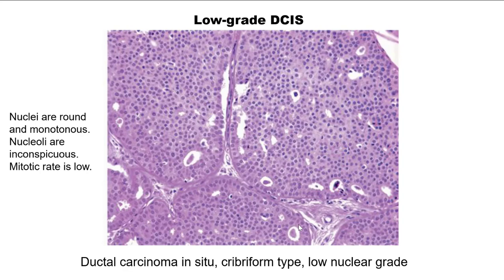Here is an example of low-grade DCIS showing relative uniformity of cells filling the lumen — not all that different from ADH-type nuclei, except with full duct involvement and multiple ducts involved. The nuclei are round, monotonous, and nucleoli are inconspicuous. In general, you will not see prominent macronucleoli, and mitotic activity, while possible, is not as frequent as in higher grades of DCIS.